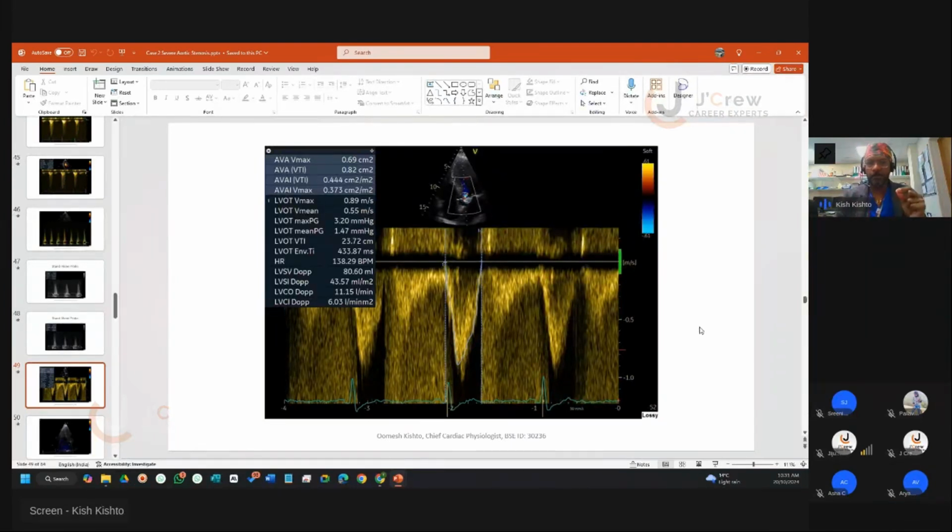Okay, just a quick recap. Make sure you get it on a few different planes, try it at a few different places rather than just apical 5-chamber view. And try to get used to using your standalone probe as well on the right sternal edge if you can. Always try it. So let's say, for example, this wasn't severe. It was 3.8, 3.7 peak velocity. Have I caught it correctly? Have I not?